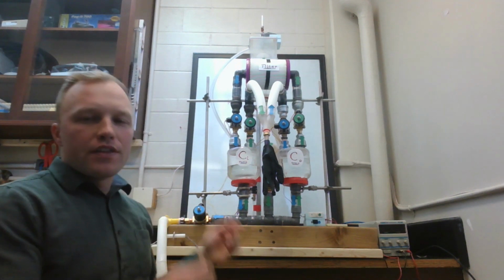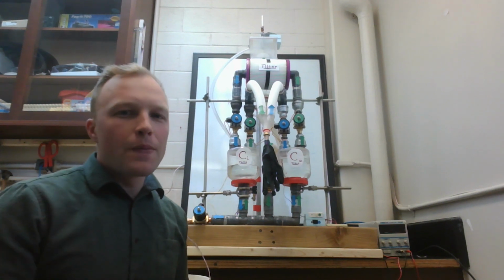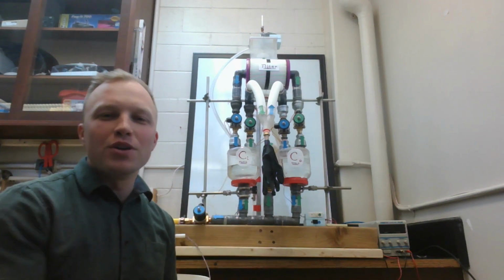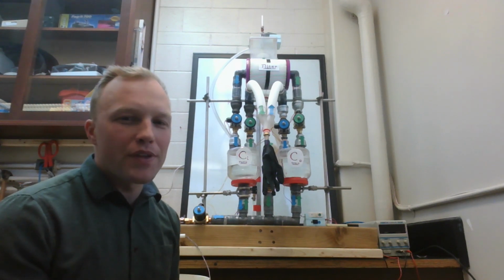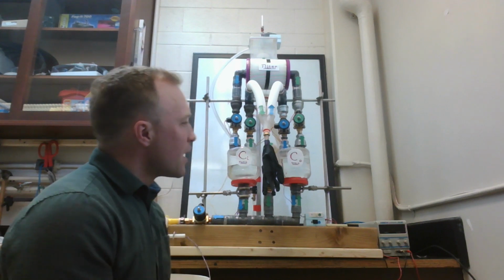I'm here at the University of Toronto working on a ventilator design challenge. Now, this is not a ventilator. I would not hook myself up to it, and you shouldn't either. But it's a prototype. It's a design. It's a swing at what you could do with a few simple parts to make something like a ventilator, and potentially one day to make a ventilator.